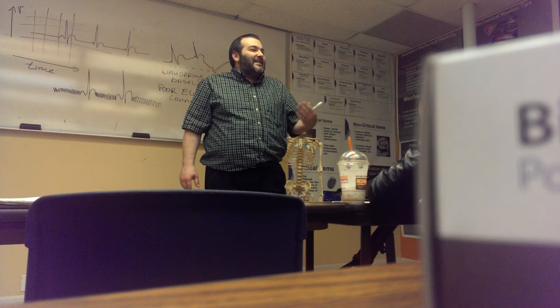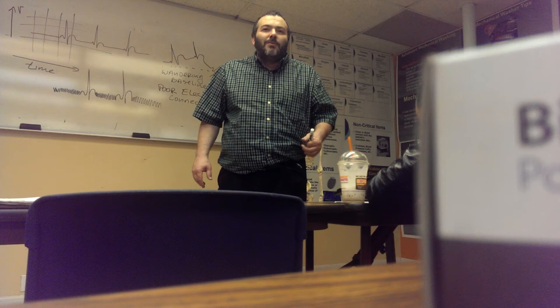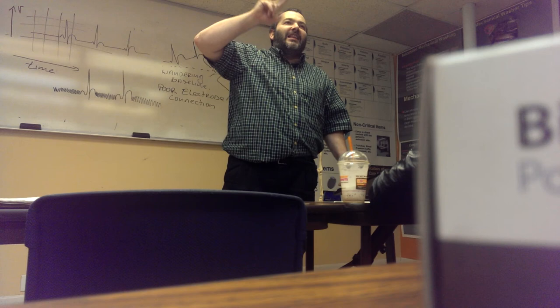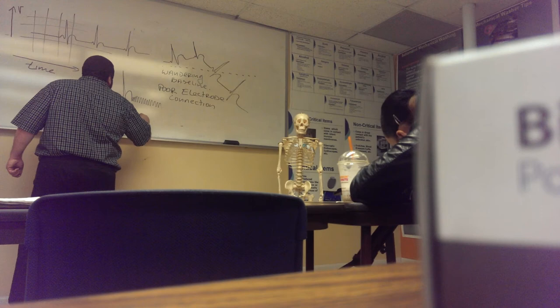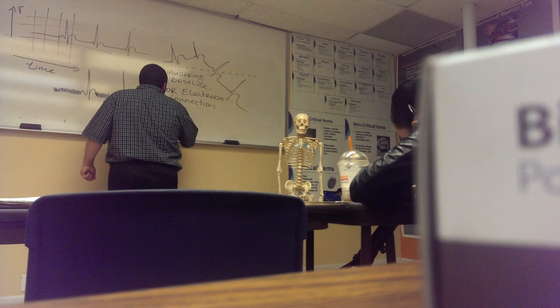Nowadays, it's even worse than it used to be because everyone and their uncle has a smartphone. Guess what? Your smartphones are constantly emitting signals. When you're doing EKGs, the darn thing has to be off. So this right over here has a name, just like this has a name. It's called the wandering baseline. This guy right over here is called artifact. Artifact simply means electrical interference.